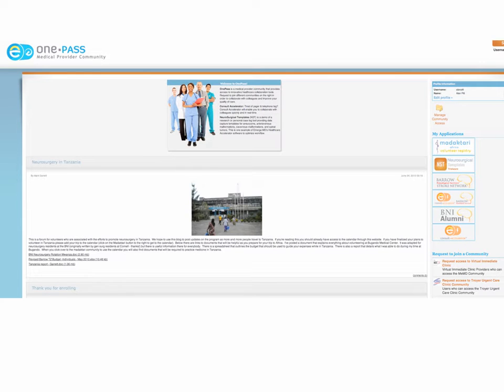In this world, something like LinkedIn or Facebook is used to open up a screen share to effectively allow someone to see the screen of the ultrasound in real time as the exam is being acquired, rather than simply sending a large file of an ultrasound that was acquired previously over the internet and then reviewing this.